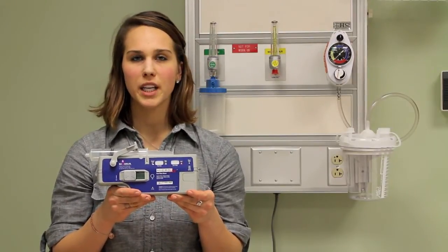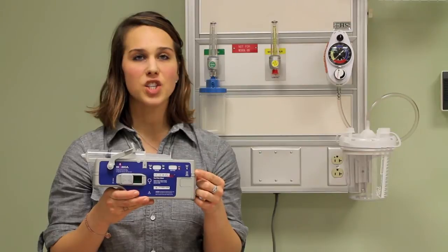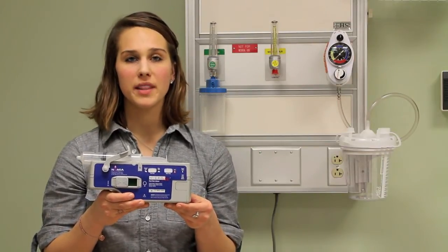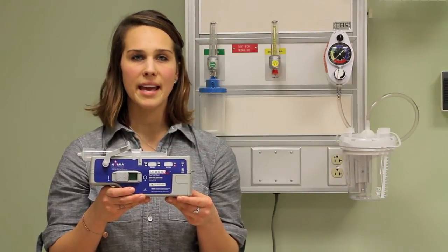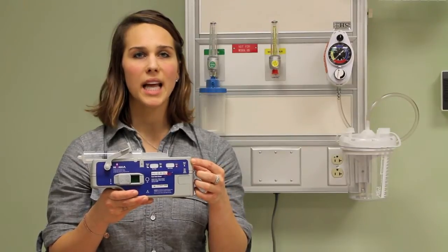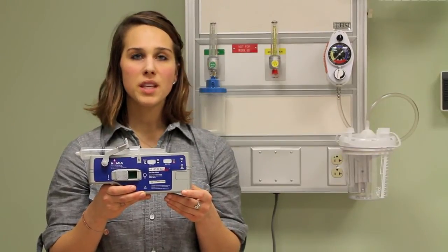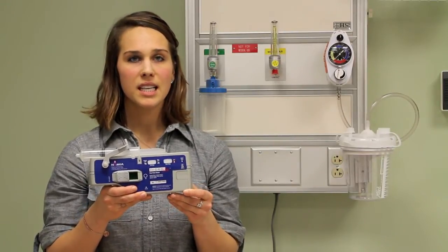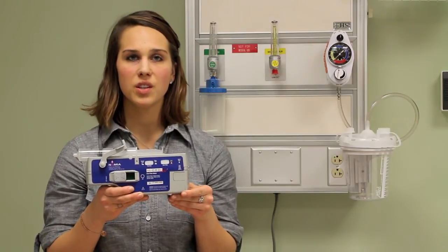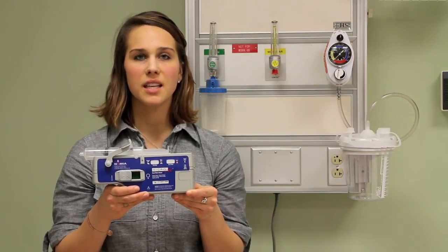If during the infusion your batteries are running low, an alarm will sound and the low battery LED light will flash. Change the batteries as soon as possible — there are only a few hours left when the alarm occurs. If there is an occlusion or any other malfunction, the top alarm LED will light up and an alarm will sound; please consult your user manual. To mute the alarm, press the alarm mute button for three seconds — it is located next to the flow rate button. The LED lights will continue to flash until the cause of the alarm is remedied. The alarm will also sound when the syringe is empty, signaling that the infusion is complete.